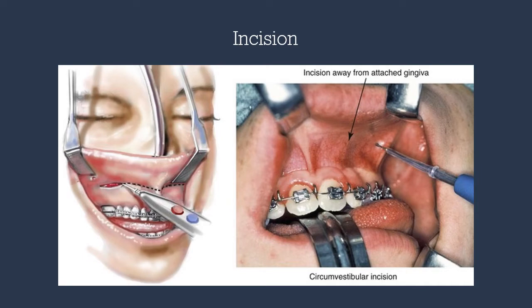Prior to the incision, the scrub tech is directed to use two toe-in retractors to expose the vestibule. The incision will extend from molar to molar, one centimeter past the mucogingival junction. We can use the Colorado tip. Once the initial incision is made, the Colorado tip is angled perpendicular to the alveolar bone in order to prevent injuries to the infraorbital nerve as well as the buccal fat pad.